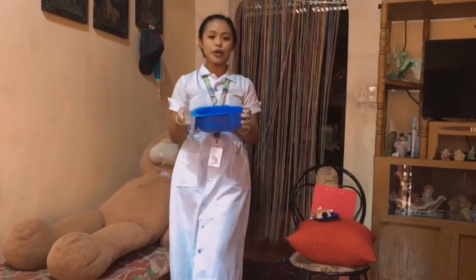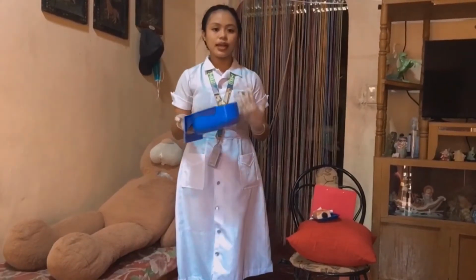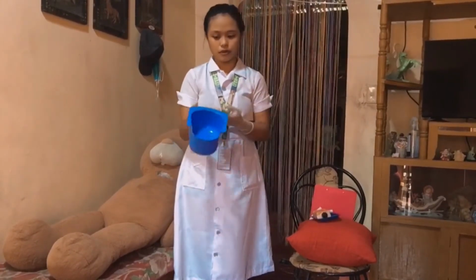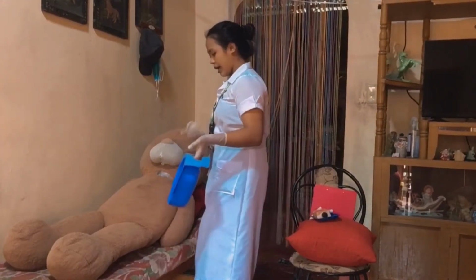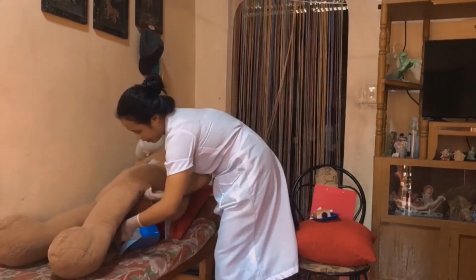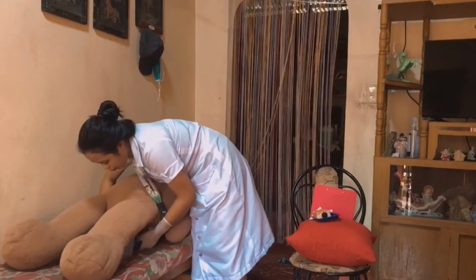Now we place our regular bedpan so that the client's buttocks rest on the smooth, rounded rim, or a sleeper pan with the flat, low side under the client's buttocks. Ma'am, ilalagay ko na po itong bedpan po sa inyo and i-assist ko. Kailangan niyo lang po umangat ng kaunti. We need to ensure that it is properly placed.